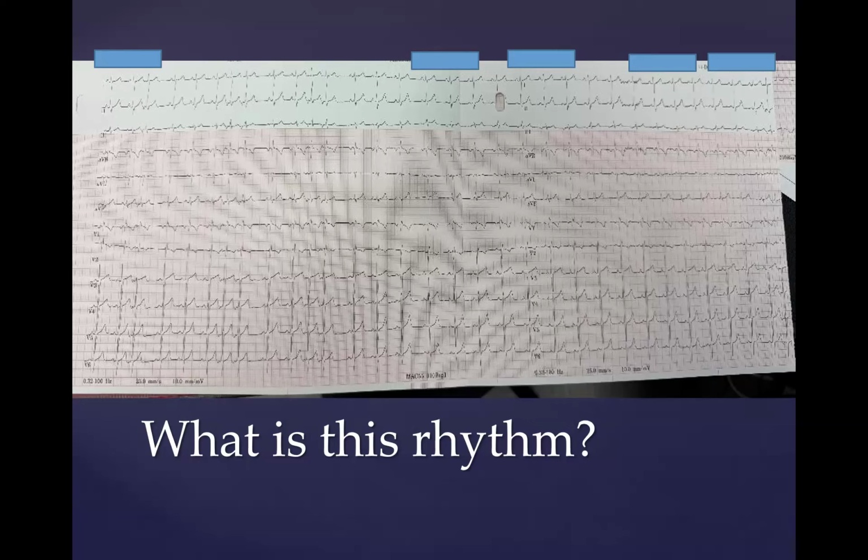That's because, first of all, people are a little bit more aggressive and willing to try freezing in areas that we might not be willing to try with RF. But I also think it's simply because the catheter is big and bulky and unwieldy. When you're moving it around the area of the triangle of Koch, it stands to reason that a very stiff, difficult to manipulate catheter might cause more episodes of transient heart block. That has certainly been my experience, although thankfully I've never had anyone have permanent block or even block that lasted more than 5 or 10 seconds. But it is frightening when it happens.